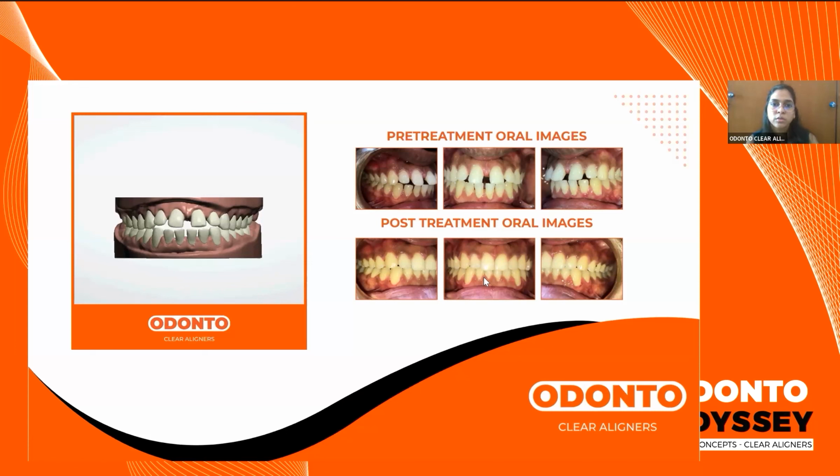Okay, so I have a question here. How much of posterior expansion, corrections, and rotations of premolars can be expected? Up to 2 mm of expansion is what we program into your aligners when we send the plan out to you. And if there are rotations, depending on the degree of rotation, we will categorize it as a mild, moderate, or a severe rotation.